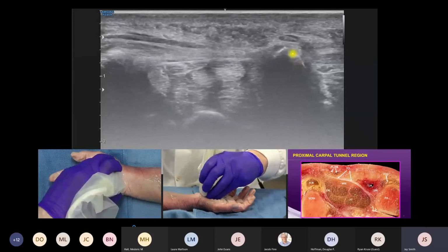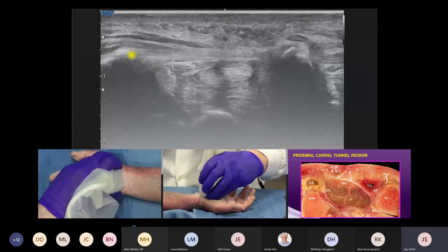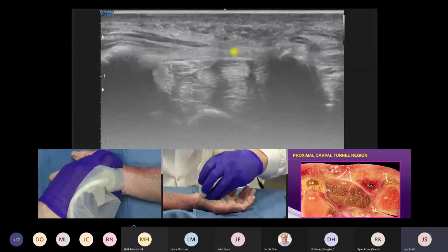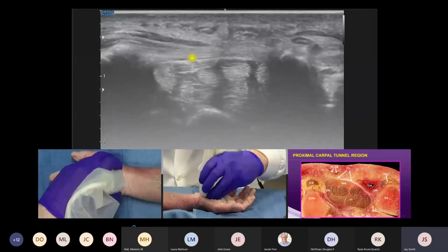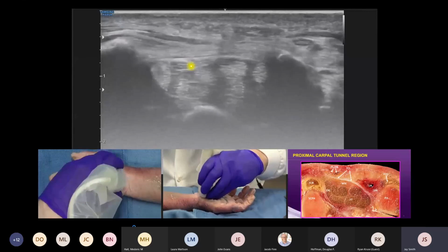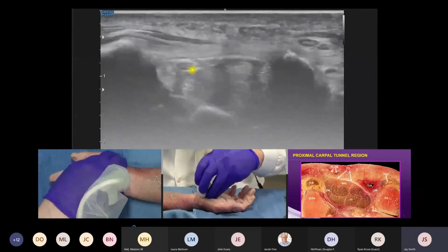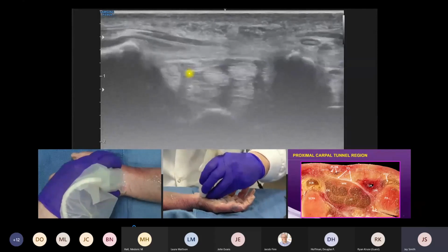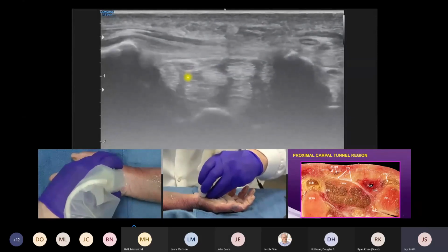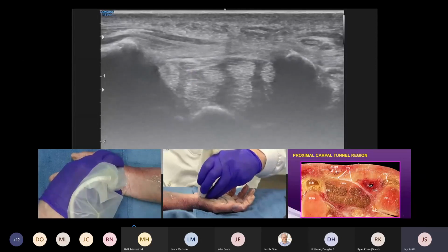So I find the hamate, and once I get the hamate in view, another important thing to do is to make sure that we get the trapezium, which is on the radial side, and the hamate horizontal across the screen. And this may require a little bit of a heel-toe maneuver if you look at the cross table view here. And then you're going to do your tilting maneuver, as you can see in the cross table image, to make sure that you control the anisotropy. And we're going to stop with this image here, and I'll freeze this and we'll talk about it.